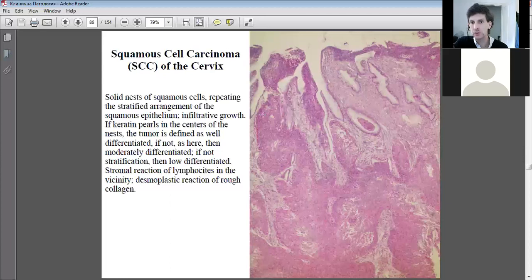The squamous tissue has also been changed, as something has damaged the dividing cells, probably viral. And what happens is the virus changes the mitotic division into abnormal structures which form nests, and these nests eventually grow into a tumor.